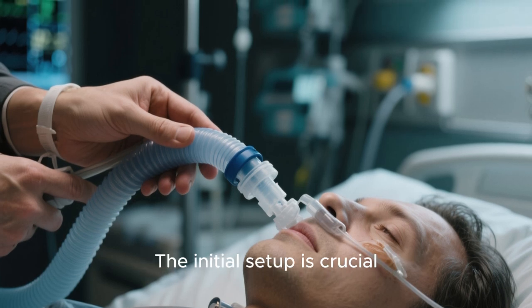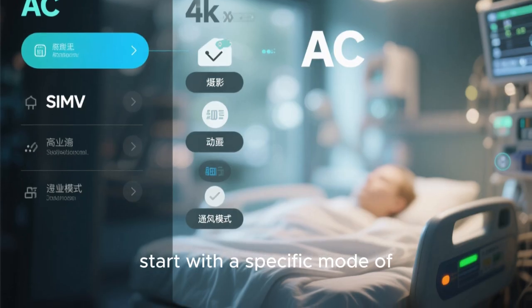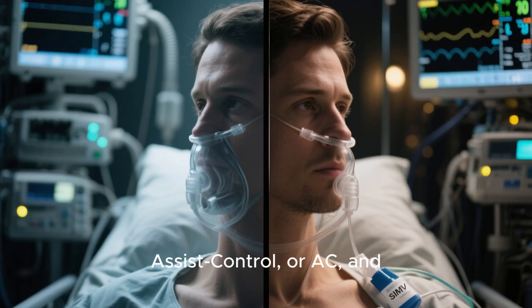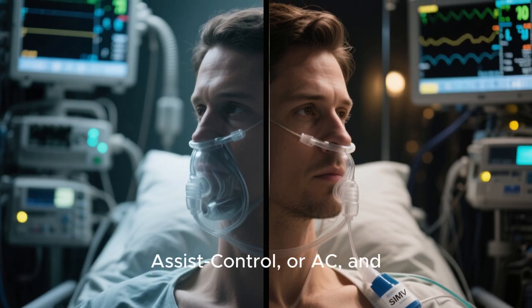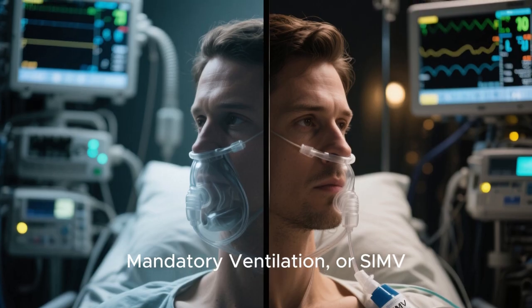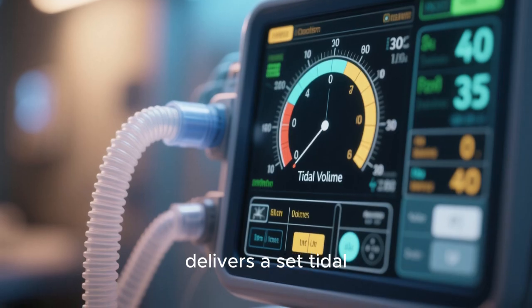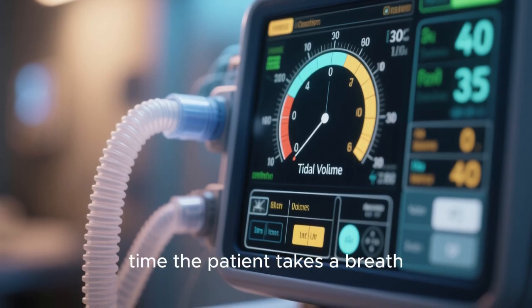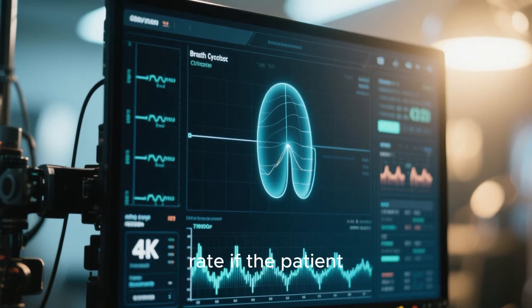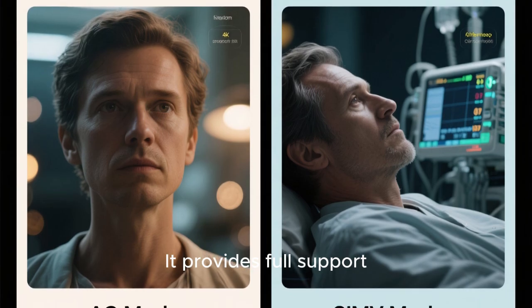So, where do we begin when a patient is intubated and connected to a vent? The initial setup is crucial. You'll typically start with a specific mode of ventilation. Two of the most common modes are assist control, or AC, and synchronized intermittent mandatory ventilation, or SIMV. In AC mode, the ventilator delivers a set tidal volume or pressure every time the patient takes a breath, and also delivers breaths at a set rate if the patient doesn't initiate one. It provides full support.